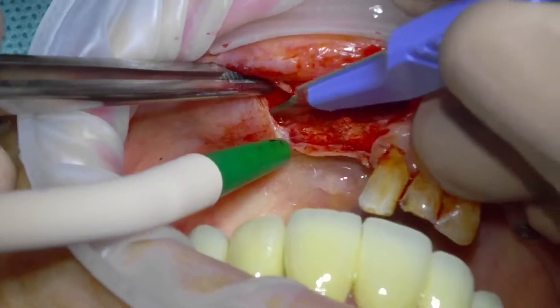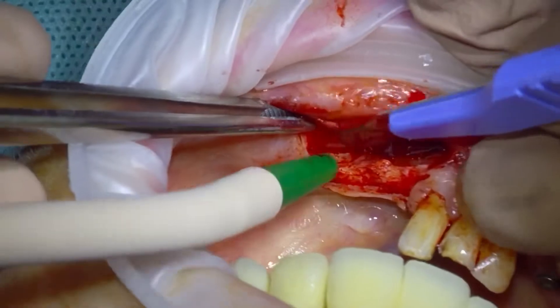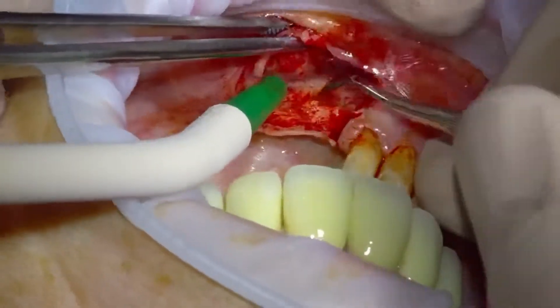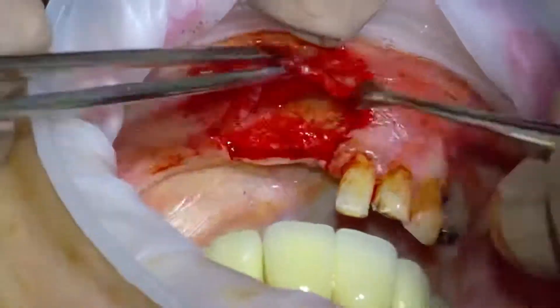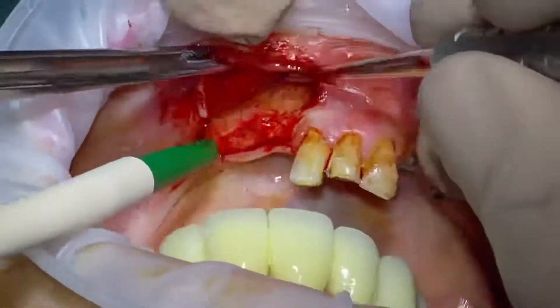Then just again trying to release distally. The mental foramen, from the CT scan, is distal to where we're working. We've incised a few of the lateral mentalis fibers and we're just checking that the tissues are released lingually.